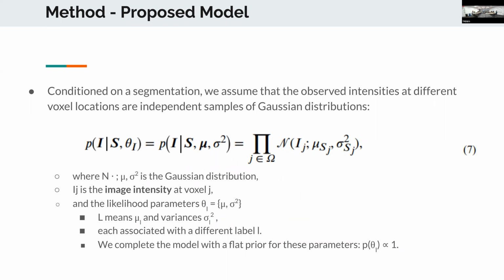Yes. Well, actually, I mean, it is possible that the labels are all fuzzy. Right? That is a possibility. That for that voxel, the labels happen to be close to uniform. No, but your atlas is not quasi. Your atlas is exact, so your prior is exact. Go back to the diagram.